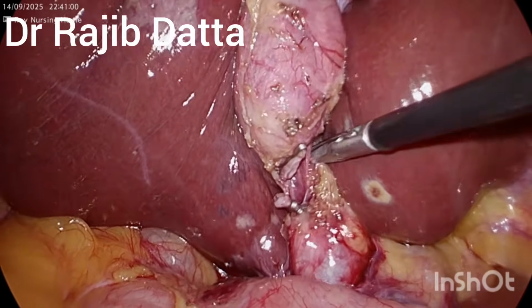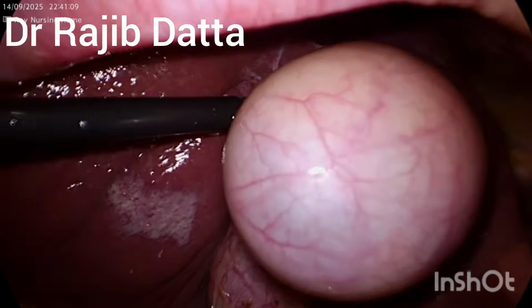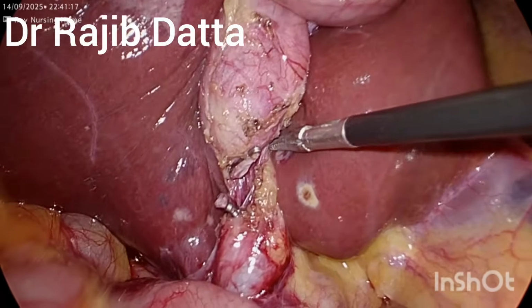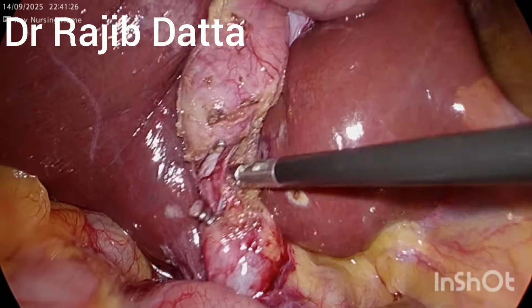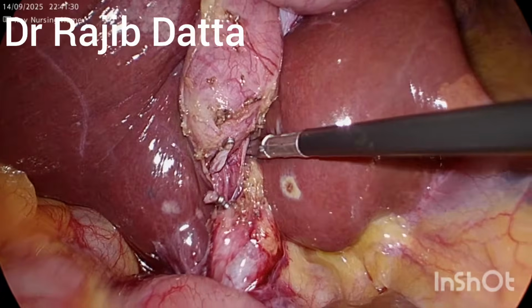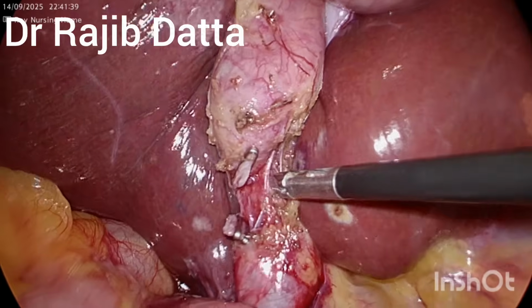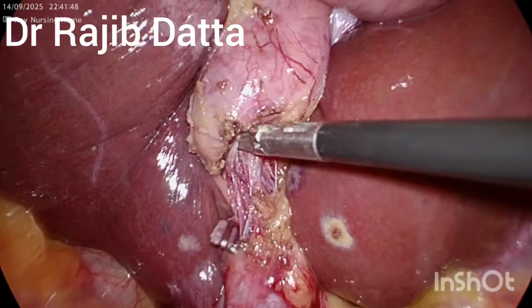Now we are going to deal with the cystic artery to be ligated. Now the cystic artery is being separated from this fibrofatty tissue.